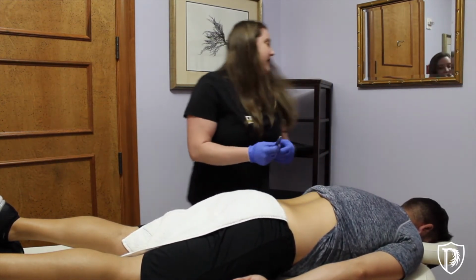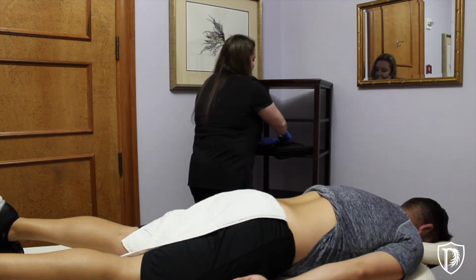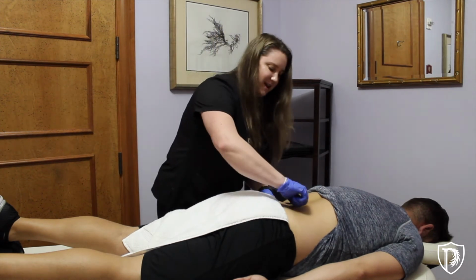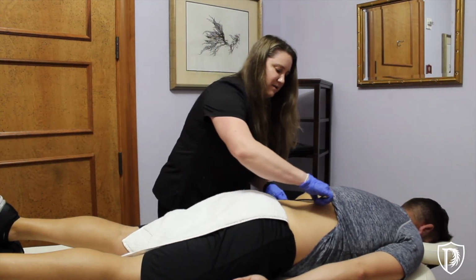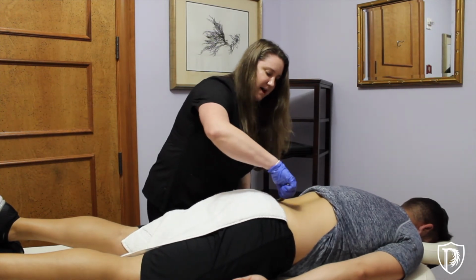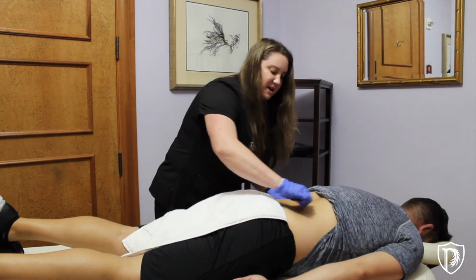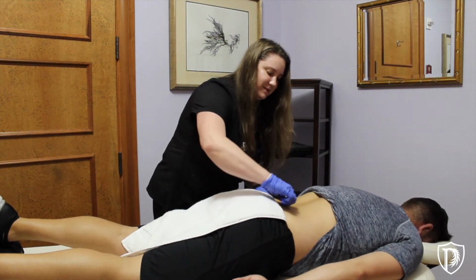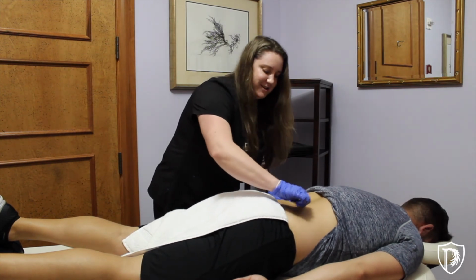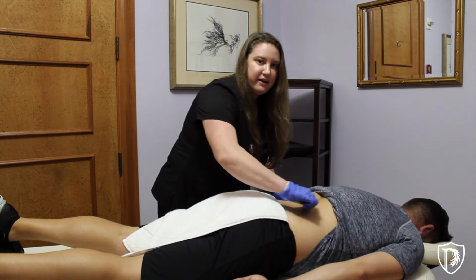So that one's good for that. And then also, because the back is such a large area, we can use the big one as well. Again, just using that smooth rounded edge to go up and down the muscles of the back and along the pelvis. I'm not digging in. The only thing that you really should expect other than relief is a little bit of redness, because like I mentioned before, we're restoring blood flow to the area.